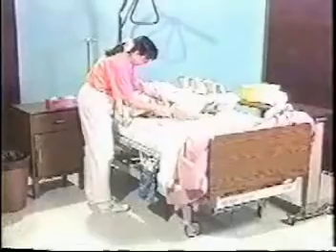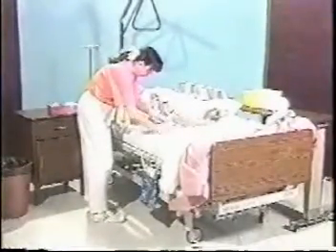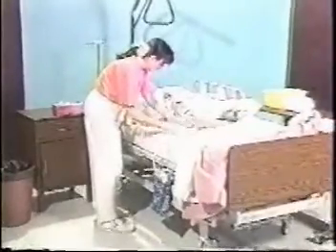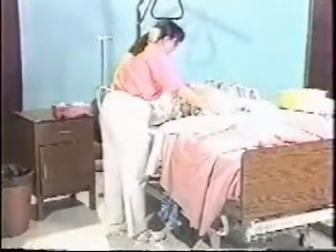After providing catheter care, secure the catheter to the leg strap if it's being used. Check to be sure that the tubing is coiled on the bed and secured. Observe regarding any pain, pressure, or skin irritation or any other changes you might notice. Replace the bedding after removing the bath blanket and underpad.